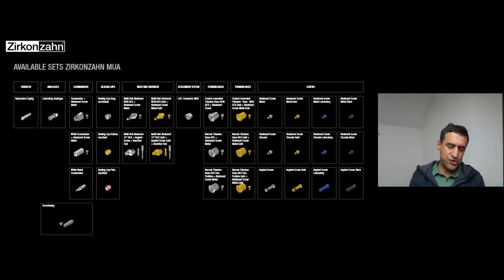The upper part is plasma treated, and the surface is not shining, so the surface is really, really nice to scan with the intraoral scanner. And the connection is in metal, so it's much safer to have this connection in metal, in titanium. And the upper part has a treated surface, so it's gray, so it's much easier and safer also for intraoral scans.